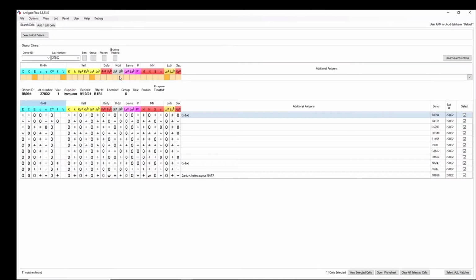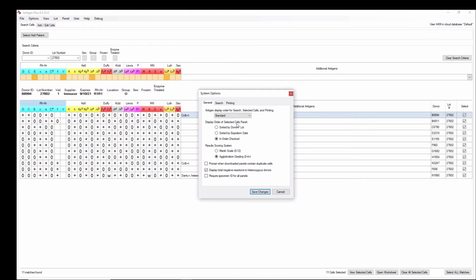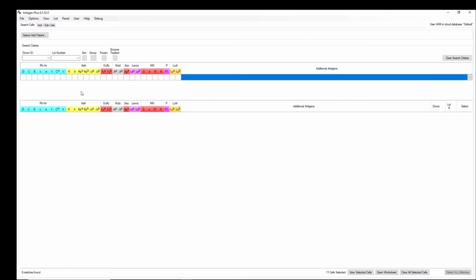But in your general work, you can change it anytime, but you're going to probably choose one that's standard, that everyone's comfortable to work with, and that is, again, in the system options, the display order. So let's make an ortho one now, because they do give us the F. Okay, so now you're going to see that everything's in an ortho array.